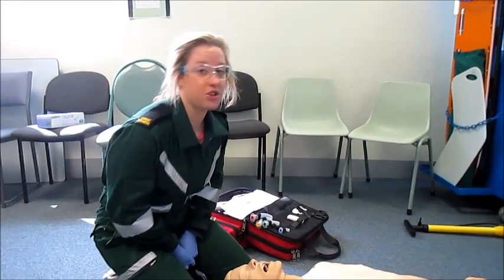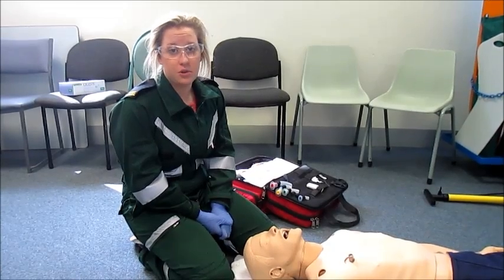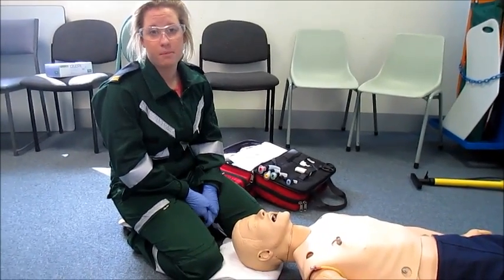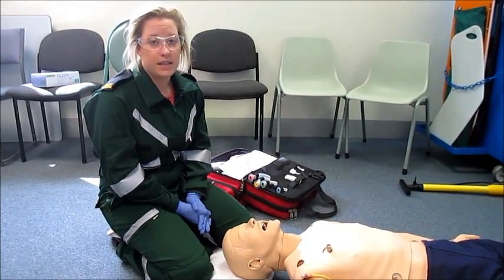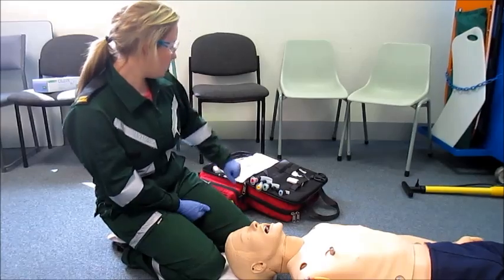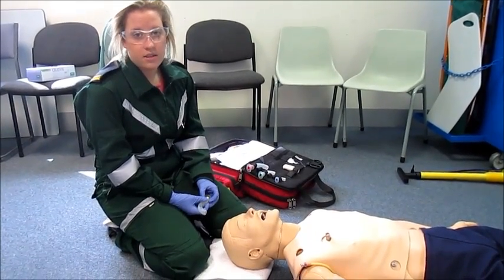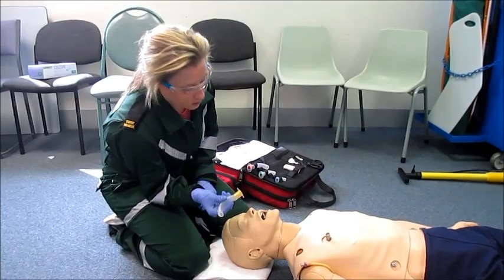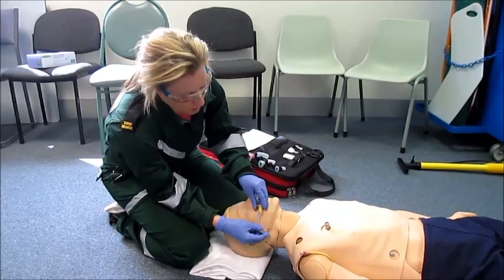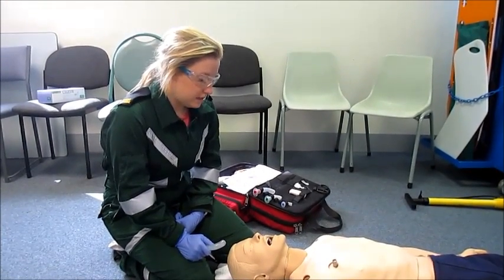I'm now going to demonstrate insertion of an OPA. OPAs are used in patients who are unconscious to displace the tongue and also as a bite block for ETTs. We do not use OPAs in patients with trismus or if a gag reflex is present. A common mistake when inserting an OPA is using the wrong size. To prevent this, we measure from the corner of the mouth down to the angle of the mandible. Using the right size ensures an optimum and patent airway.